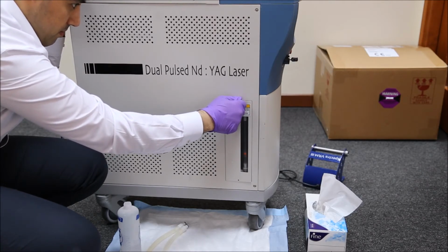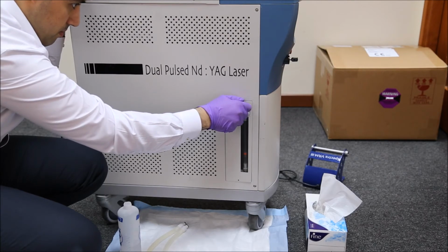Nine. Attach the water level window by screwing the two bolts.